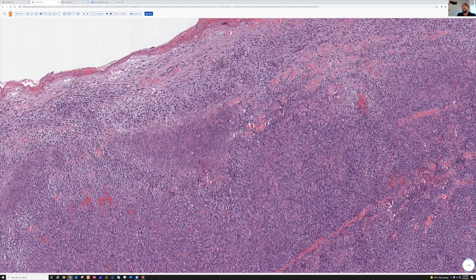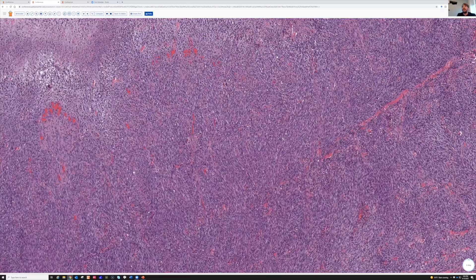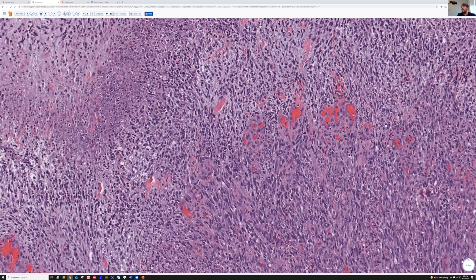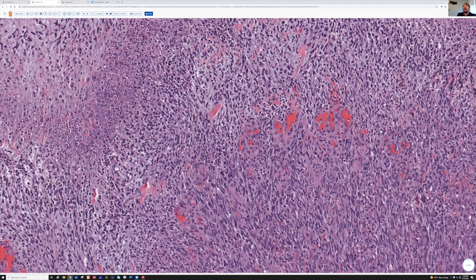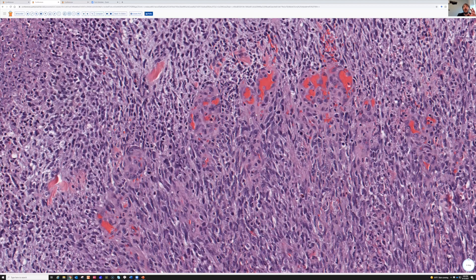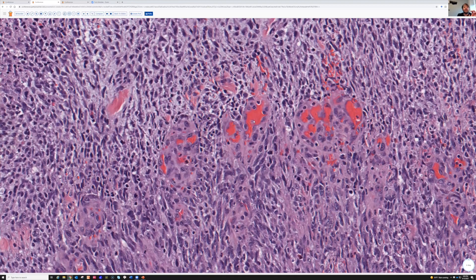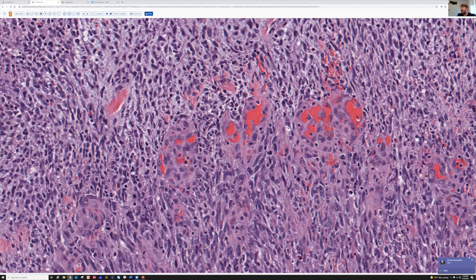It varies from case to case. The other thing I was going to point out is a trick Dr. Weiss taught me, and I have found it to be incredibly useful: in MPNST, you often have around the vessels an enlarged epithelioid change of the tumor cells that cluster around dilated vascular spaces.